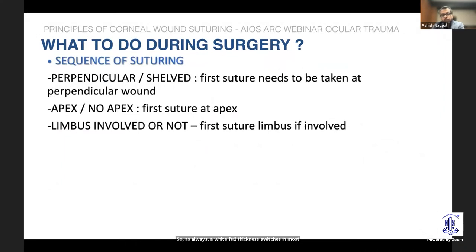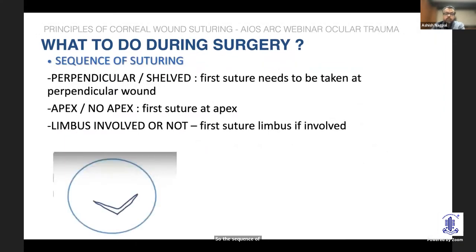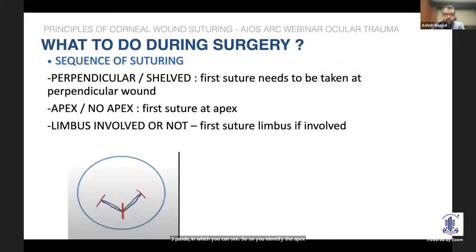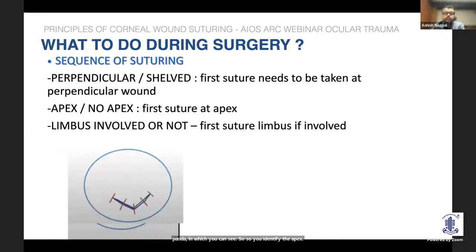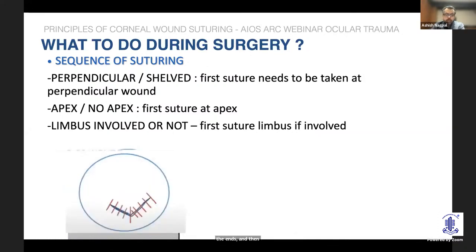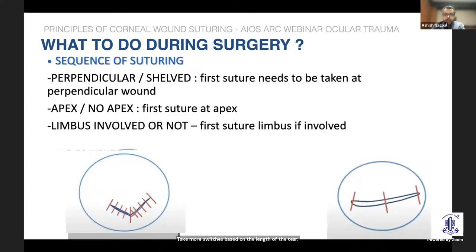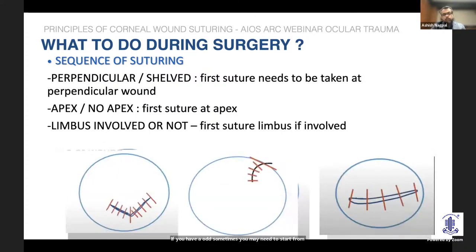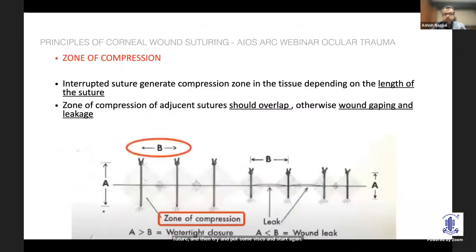The sequence of suturing is something each surgeon must figure out from the specific wound. In this small animation made by my colleague Dr. Yathri Pandya: identify the apex first, suture the apex, then suture the ends and titrate accordingly, taking more sutures based on the length of the tear. If there is a limbal tear, you can start from there. Sometimes you may need to start from the other end, or place a temporary broad suture at the apex if the wound is collapsing, then introduce viscoelastic and start again.